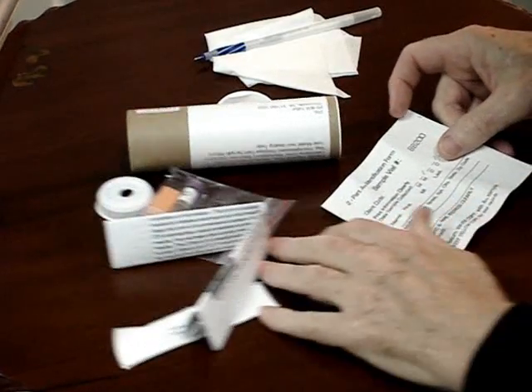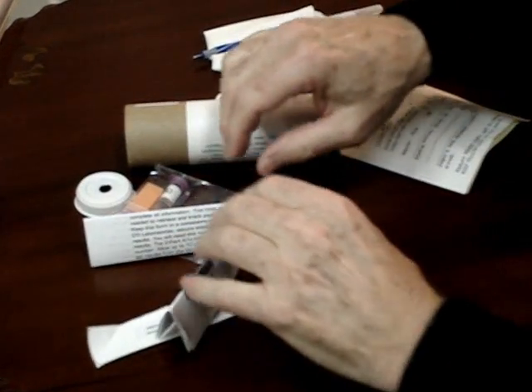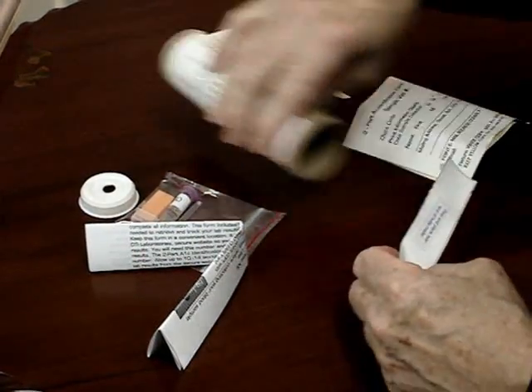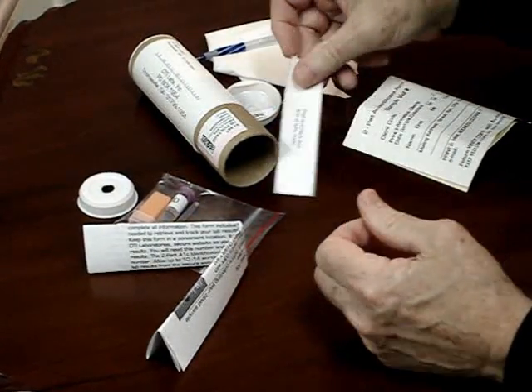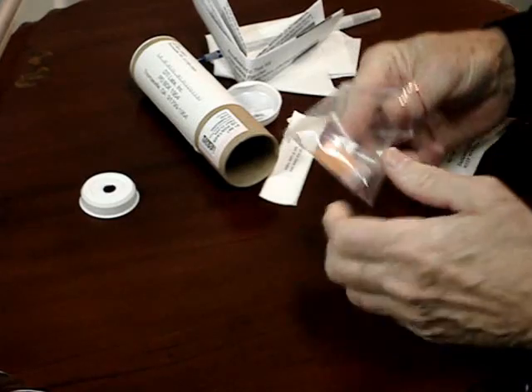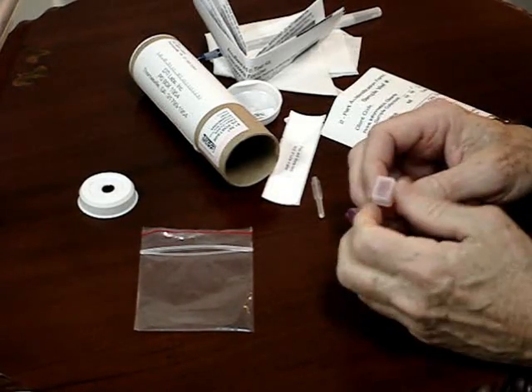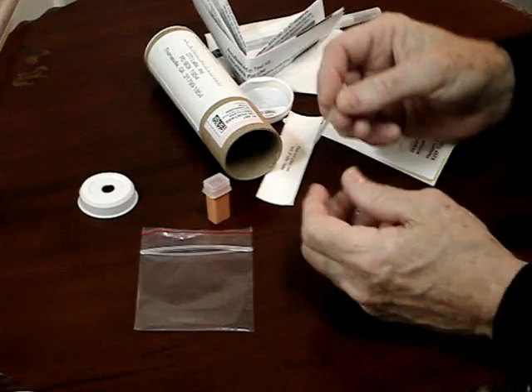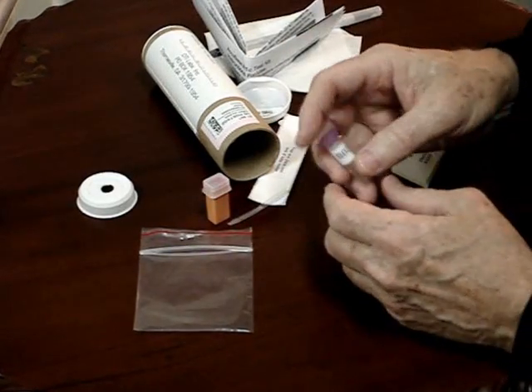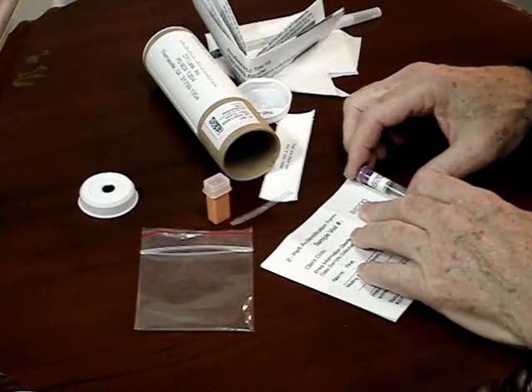Components of the kit include a two-part lab identification form, a white and yellow copy. Next, a strip of sealing tape used to seal the mailer after you have collected your sample. Next, the instructions for use, and a Ziploc bag containing 3 items, a single-use lancet, a capillary tube with predetermined marks to fill to with blood, and a numbered sample vial containing reagent that matches the sample vial number found on the lab form.